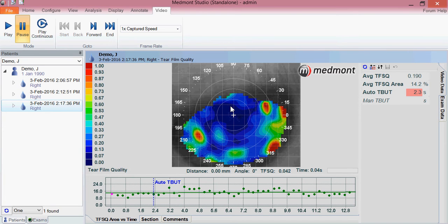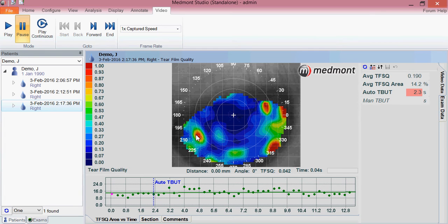Where you see dark blue, that's where the tear film is very smooth and even, indicating good quality tear film. Where you see hot colors, that's where the tear film is likely in breakup — where you have high points from one imaged area to the next, where the tear film may not be smooth or even.